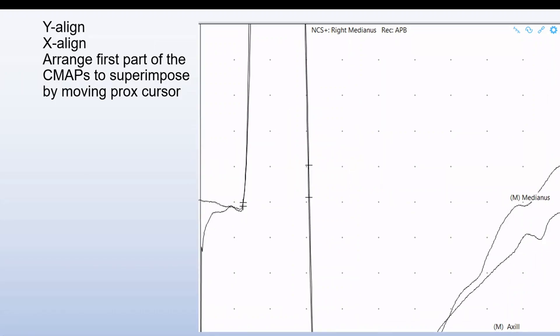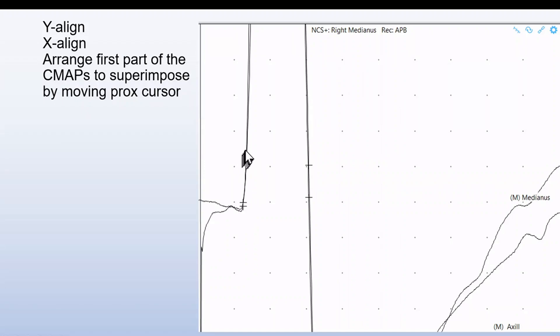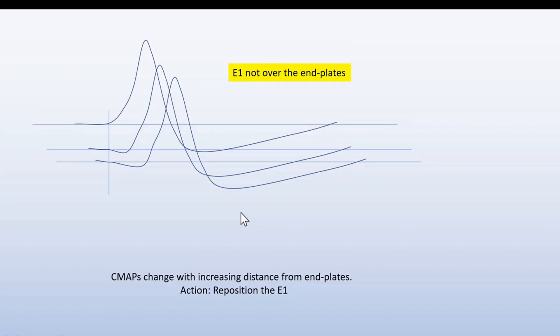By superimposing the signals in relation to the takeoff cursors, they align completely if the cursors are set on the correct place.